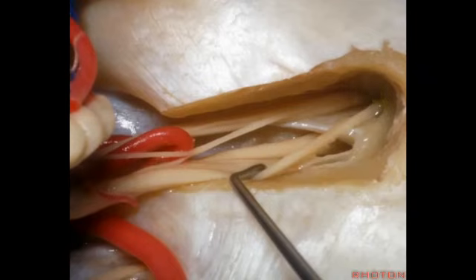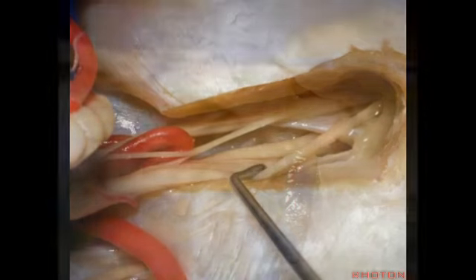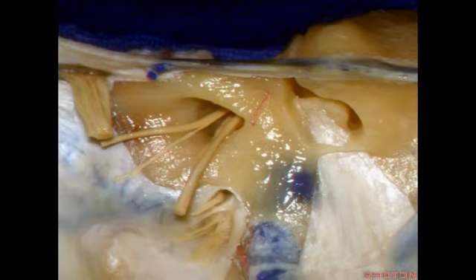Bill's bar, superior vestibular, the inferior vestibular, cochlear, facial, and intermedius. So now, if you drill lateral to the porus of the meatus, if the pathology goes into the vestibule or the canals and hearing is lost, you can drill all the way lateral into the vestibule.